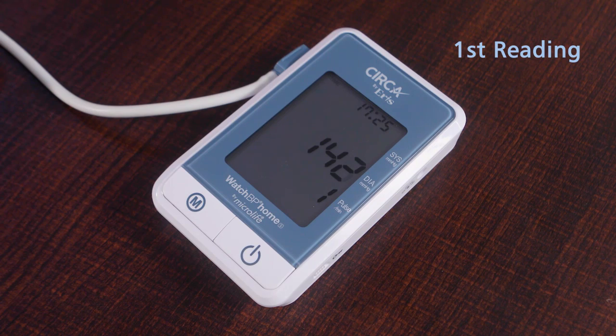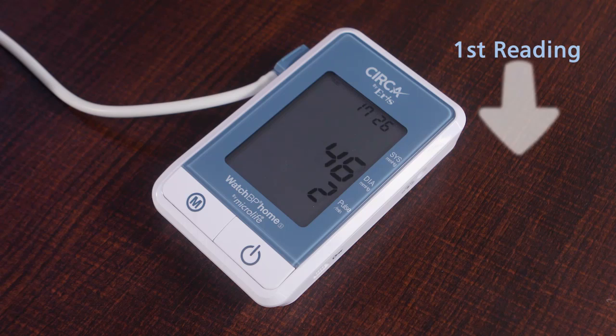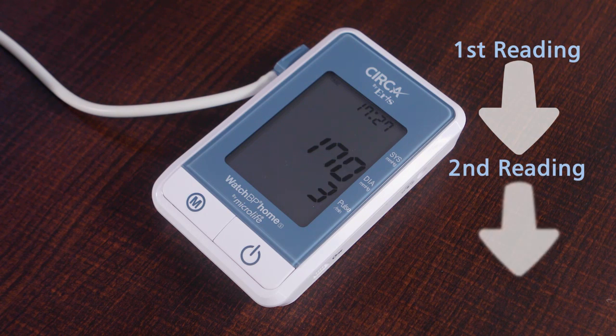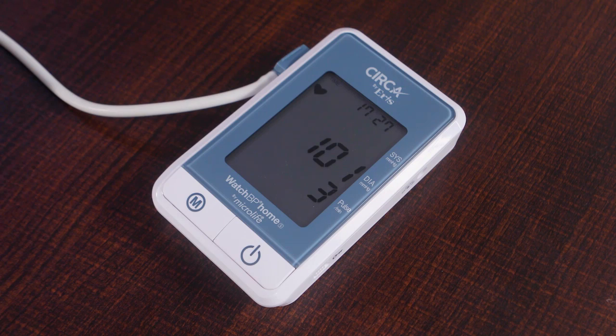Continue to sit in the same position. After 15 seconds, the machine will take your second reading, with the cuff compressing and deflating again. The same procedure will be repeated for the third time. In case of movement or too much variation in blood pressure, the device may take a fourth reading. After the third measurement, the result will appear on your device screen.